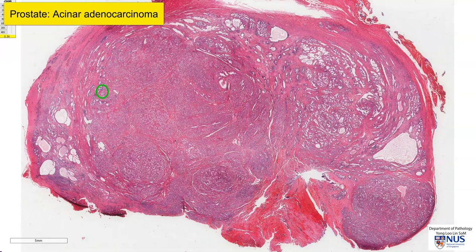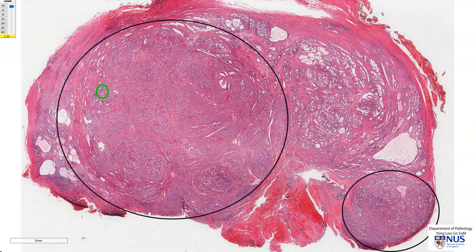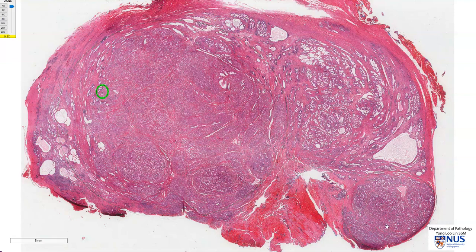We are looking at a complete transverse section of the prostate gland. This is the posterior surface, this is the anterior surface. The lateral lobes are here and here, and we have the anterior and posterior lobes. The location of the tumor is predominantly in the left lateral lobe, with a small area of tumor in the right lateral lobe, and these are both also at the posterior surface of the prostate gland.